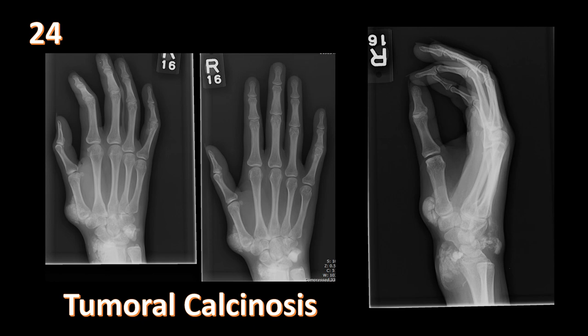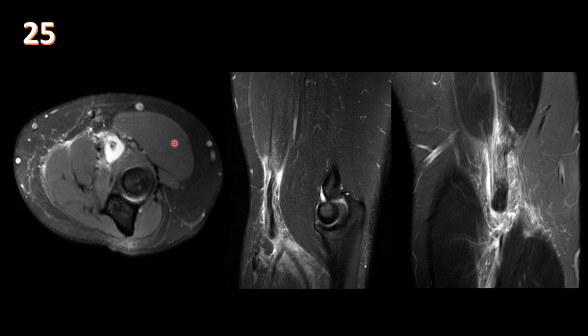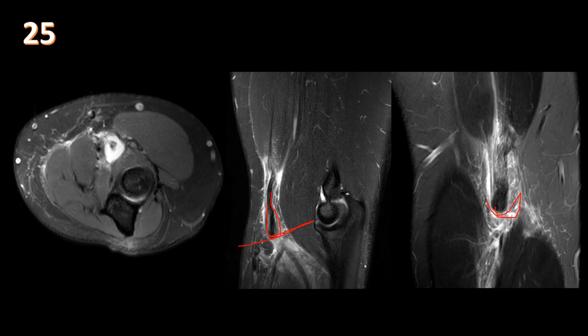Axial, sagittal, and coronal T2 fat-suppressed MRI images of the elbow show fluid around the distal biceps tendon, which is retracted and not inserting at the radial tuberosity — it is stuck at the level of the lacertus fibrosus, the typical site of retraction after tear. On radiograph, the Popeye sign is seen as the retracted biceps muscle appears very prominent. When performing elbow MRI for a biceps tendon tear, include the proximal arm to assess the amount of retraction from the radial tuberosity.